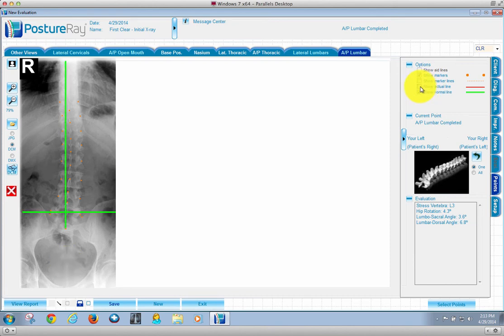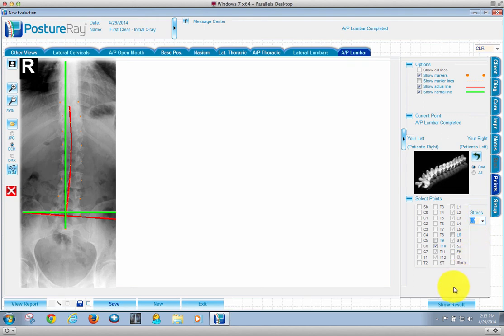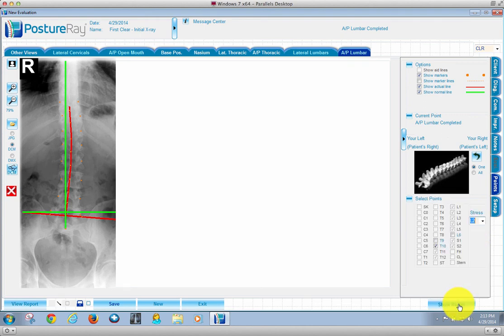Now, once I put the lines on the film, if I need to go back and change the apex, say if I want to do L2, change the stress, notice how it changed the red line and the values.